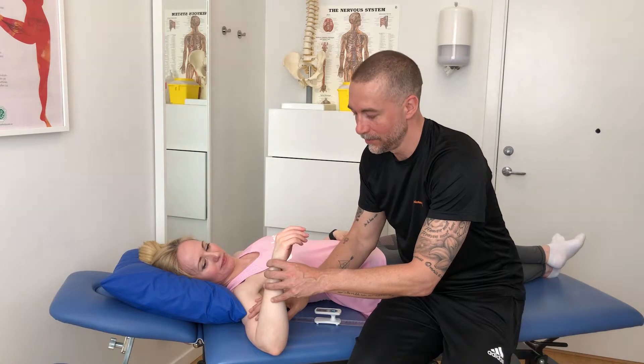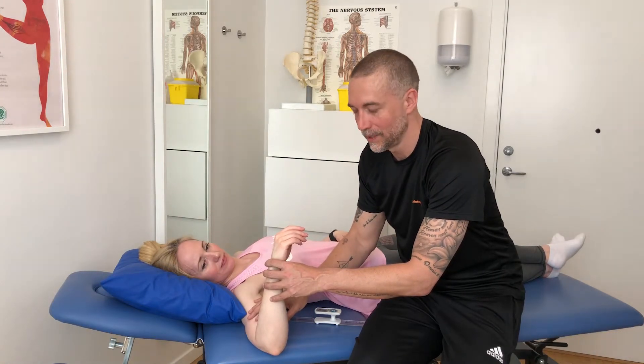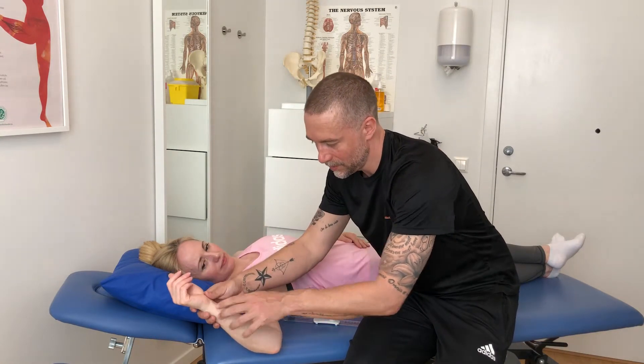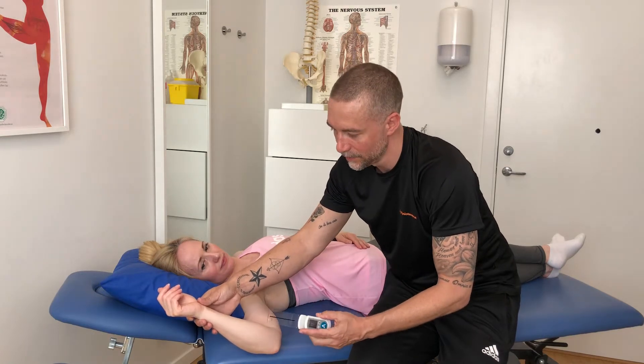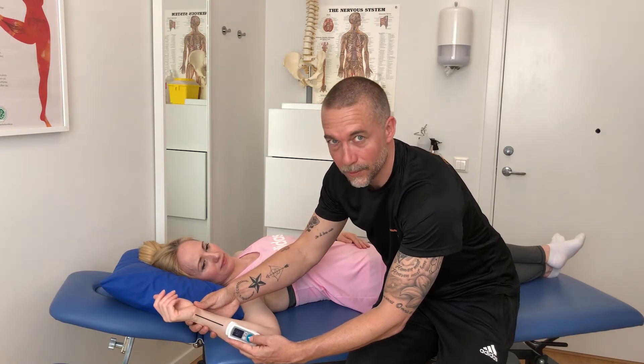I put the device to one side because you don't need to follow the joint through the motion — the device remembers the plane that you measure. Help the patient to reach the full range of motion in the lateral rotation, then align the device again.